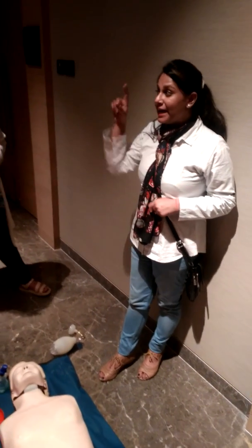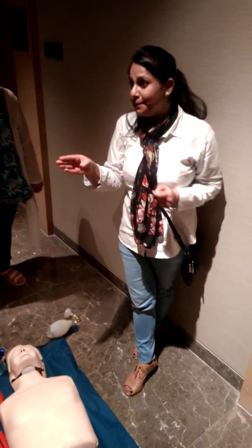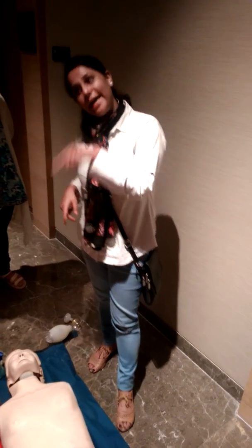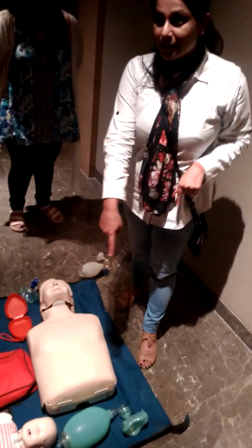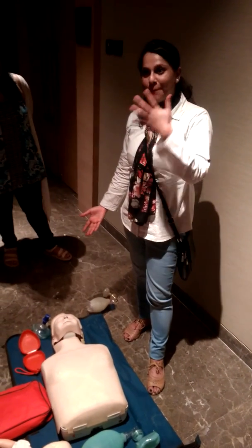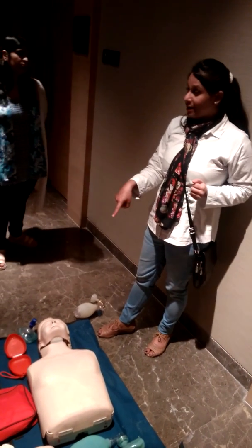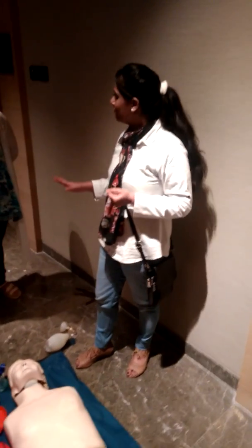Remember, in our adult chain of survival, we said that after high quality CPR, our third priority is defibrillation. So this person is bringing an AED also, and this person is bringing a bag-mask also. The function of this bag and mask is to ventilate the victim. We are already ventilating by mouth-to-mouth or by mask, so the new thing is the AED.